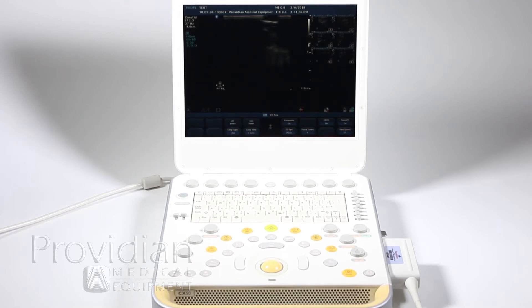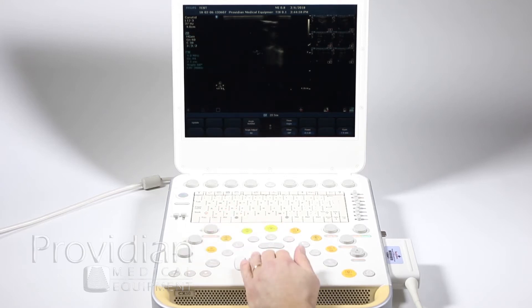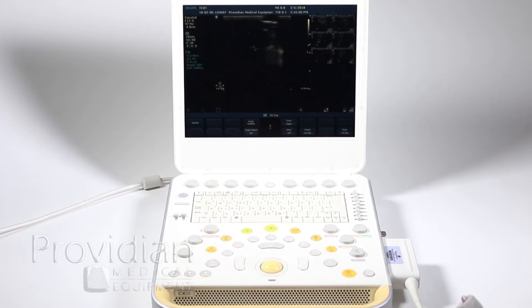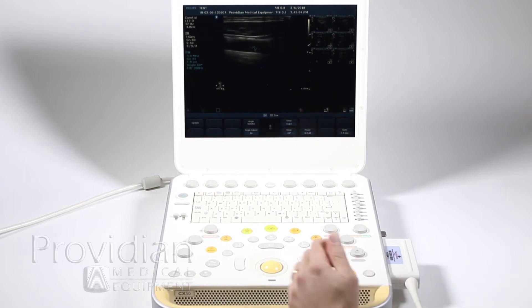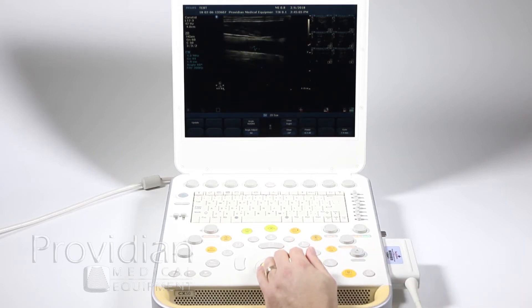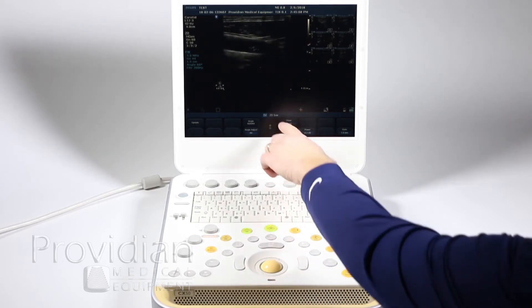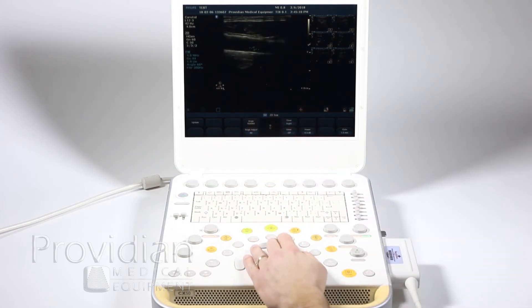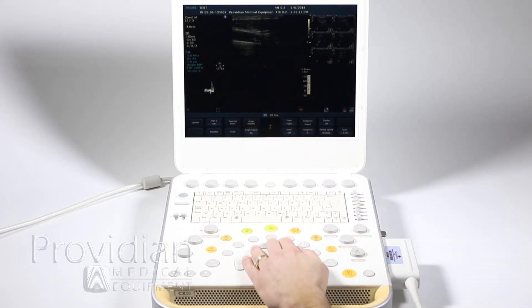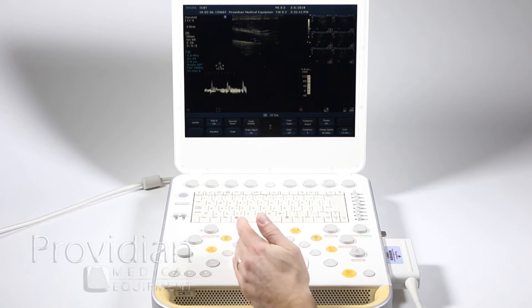PW Doppler is pretty straightforward. You're just going to hit PW and you'll get your cursor. I'll just get a random image up here. And here you can change the sample volume. I can hit Enter and go right into Pulse Wave Doppler.